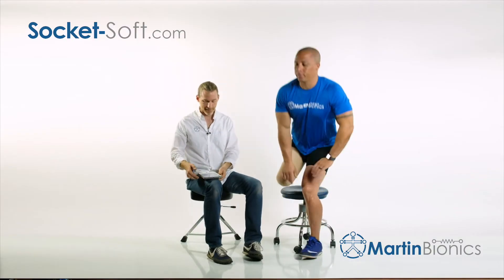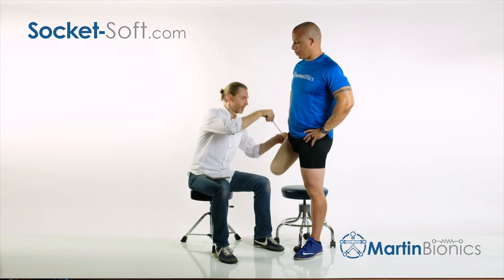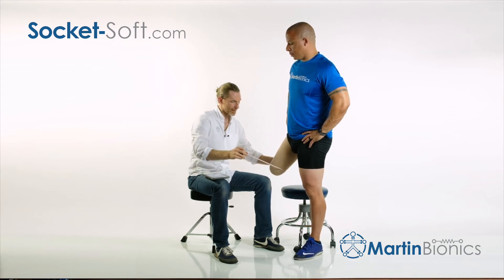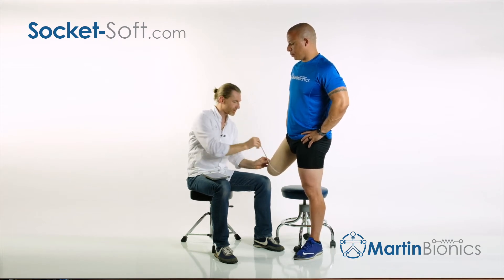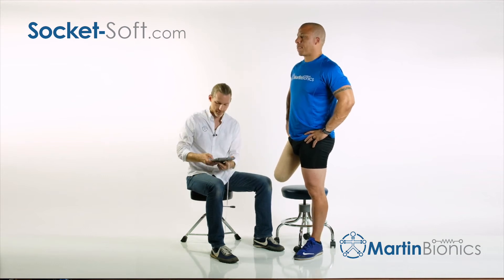I'll input the proximal limb circumference — I'm going to take the proximal circumference at the groin level. Then I'll go and take the distal circumference, which I'll need next about four centimeters above the distal end, and input those measurements.